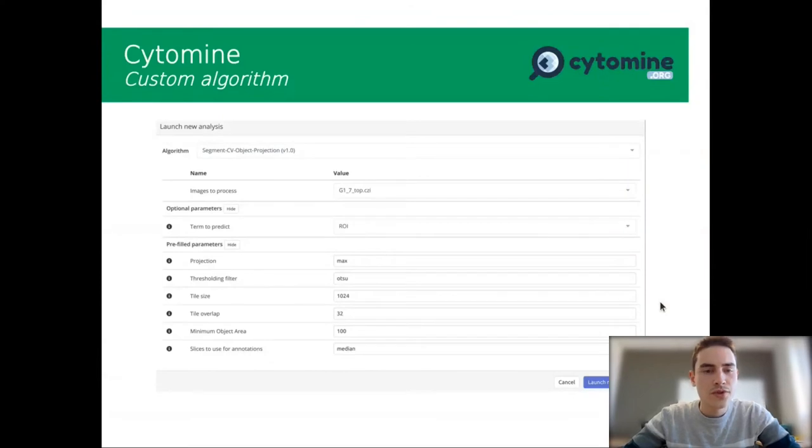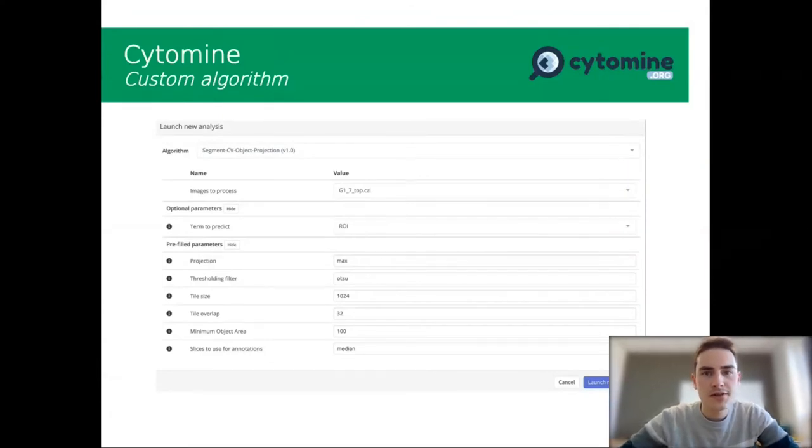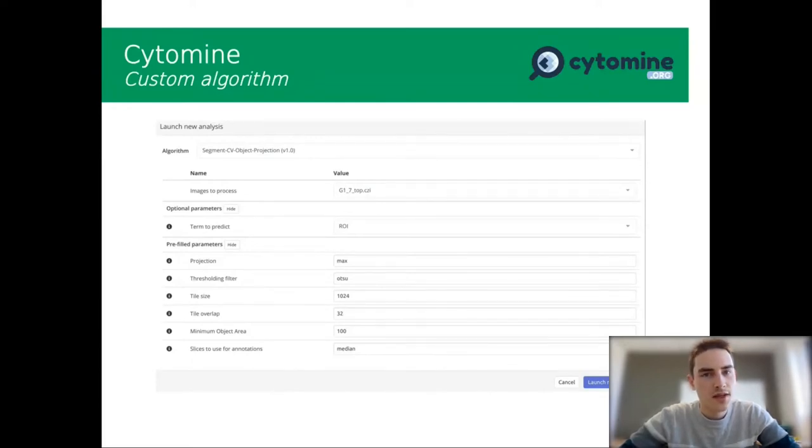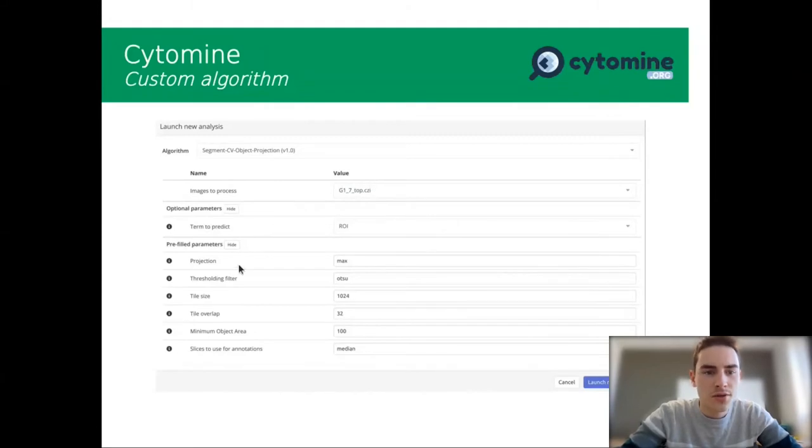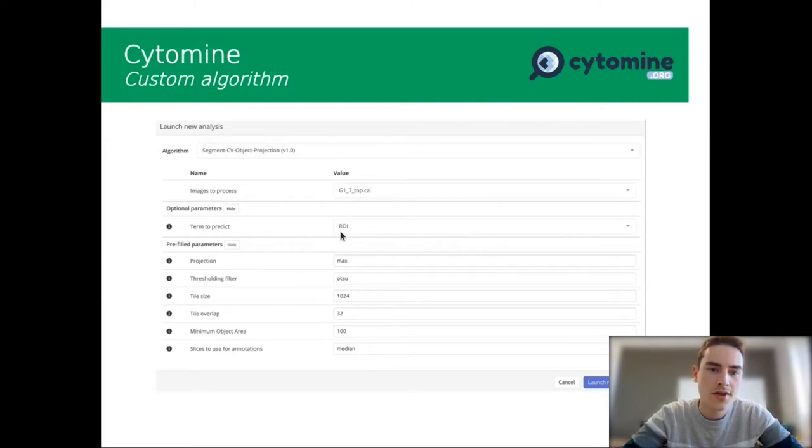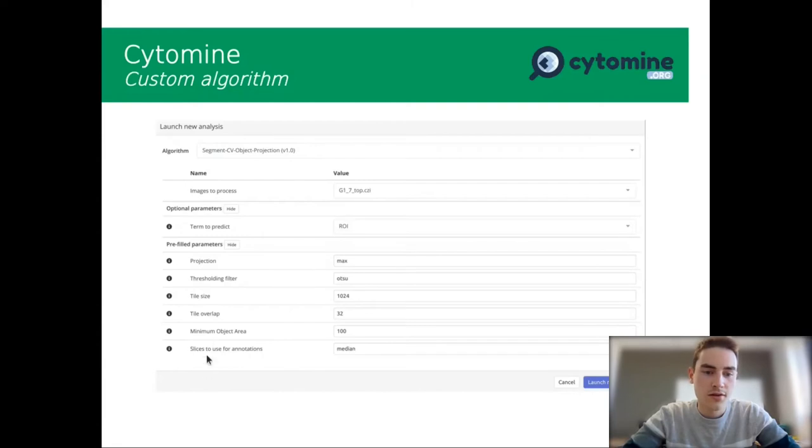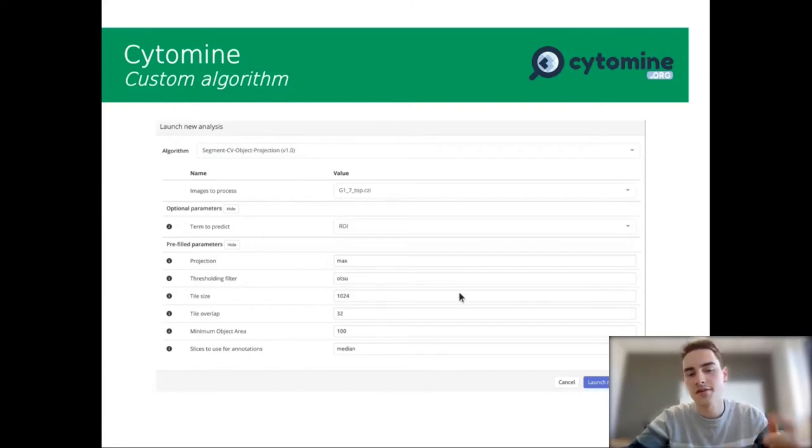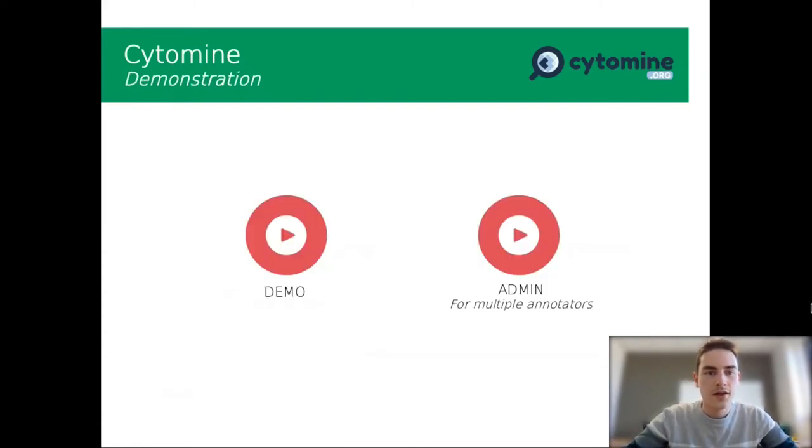You can use custom algorithms. Here we have an example of custom algorithm where you decide what image to process. So it is here. And all the parameters for detection of region of interest, ROI here. It is a term to predict. So here it is thresholding with the Otsu filter, etc. You can use some parameters.